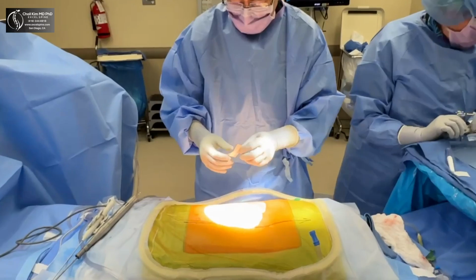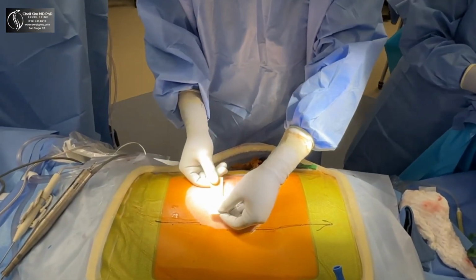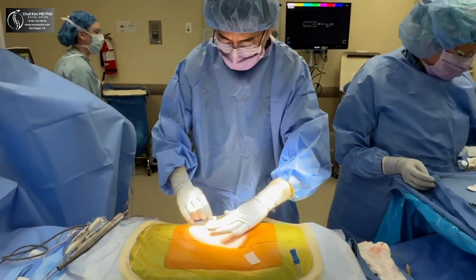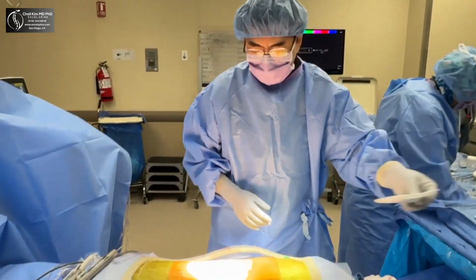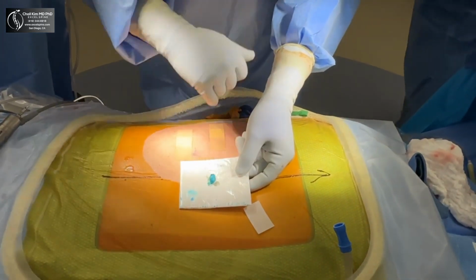Surgery's all done. It was boring, if there's such a thing. That's good. That means it was straightforward. I found a lot of great stuff. And the neuromonitoring signals improved significantly before and after. And at 4 or 5, look at that. That's not even all the pieces. Those are the ones that I just recovered.